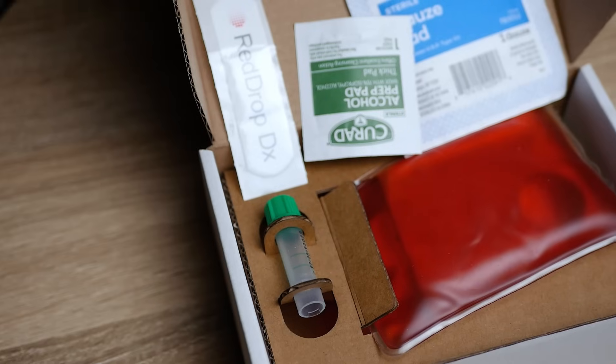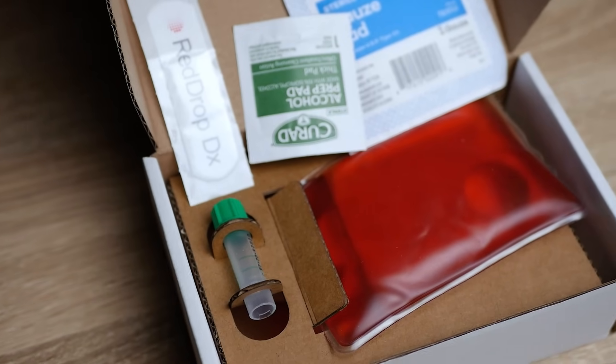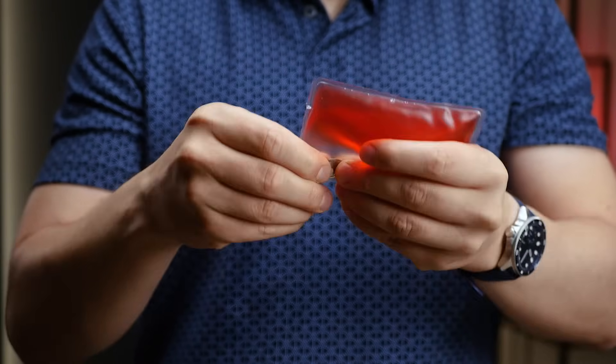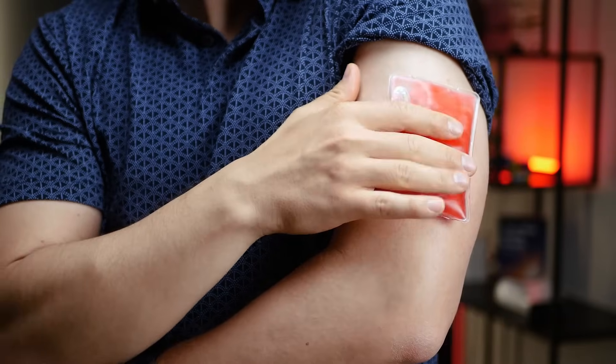Then we remove the device and send the sample back to the lab. The process is designed to be virtually painless and straightforward. Next, here is RedDrop. RedDrop's device also targets the upper arm and incorporates a heat pack to increase blood flow, ensuring an efficient collection process.